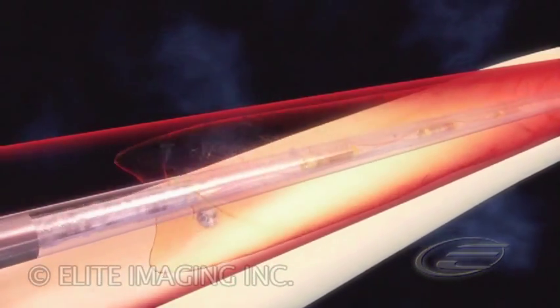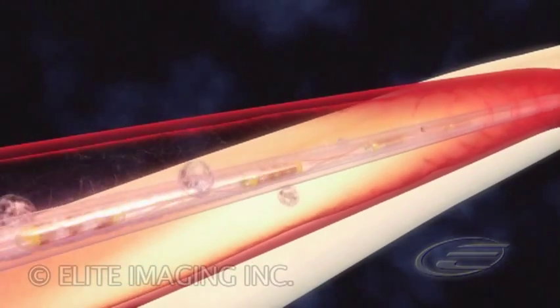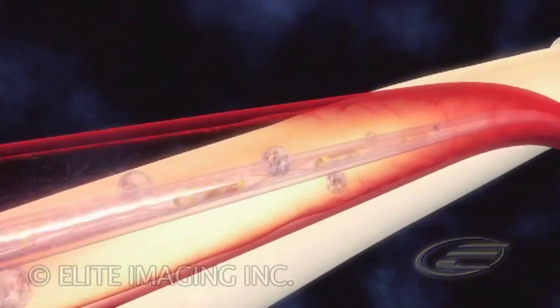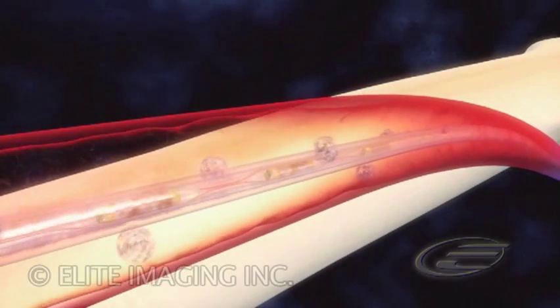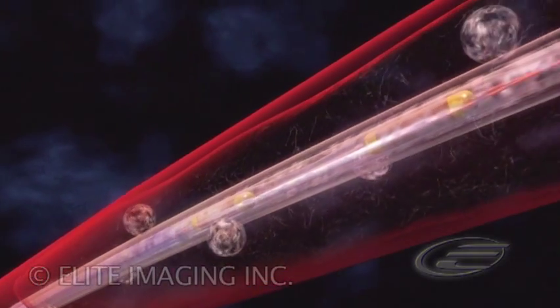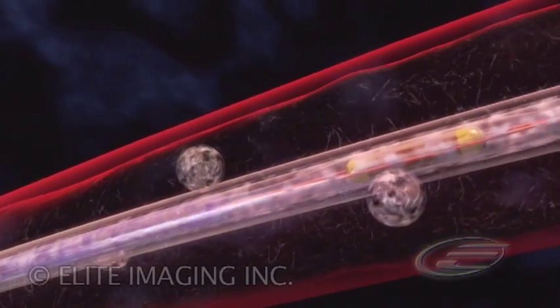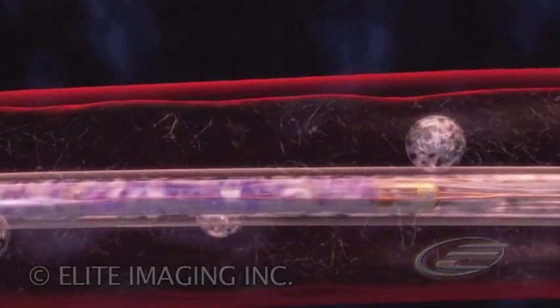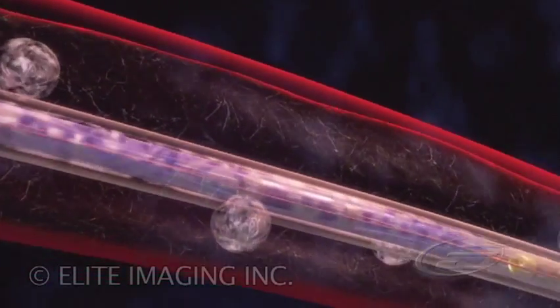The drug delivery catheter is optimized to deliver drug uniformly through the side holes along the treatment zone, while saline infusion to cool the ultrasound core exits from the distal tip of the catheter.